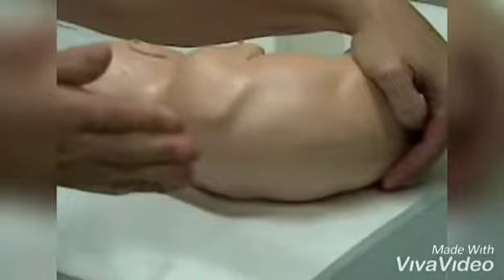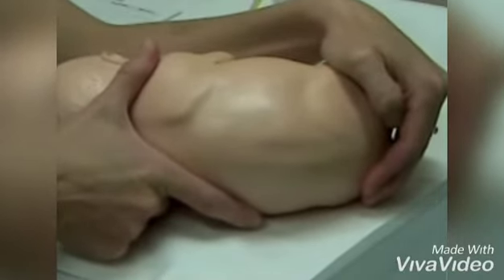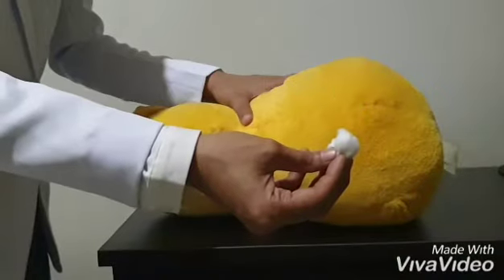Positioning of the infant is crucial for a successful lumbar puncture. You must have a good assistant to position and hold the infant. Hold the hips and shoulders, curling the child in a position to open up the interspinous processes.